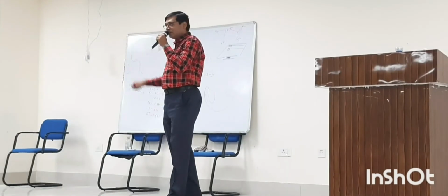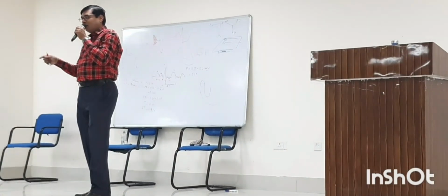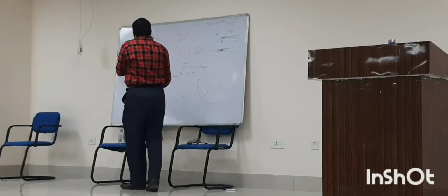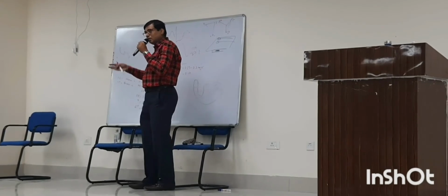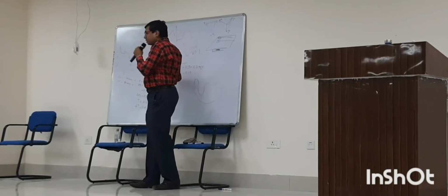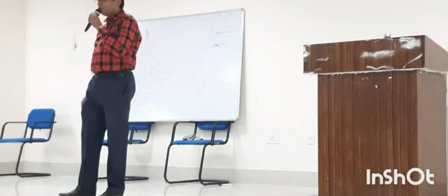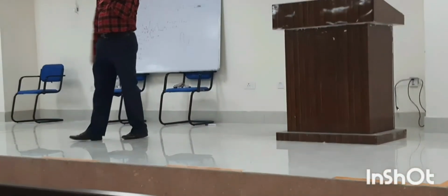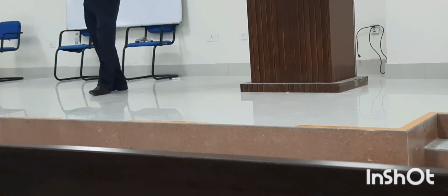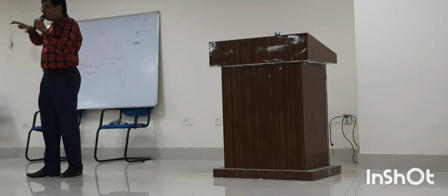Look, an important issue is here. Atrial depolarization. Another issue is the pattern of depolarization is P, Q, R, S, like total depolarization. But the repolarization pattern is just T. Why not the same? Because ventricular repolarization is not in the same pathway where it depolarizes. Depolarization is from SA node to AV node, bundle of His, and interventricular septum, then ventricular muscle wall.